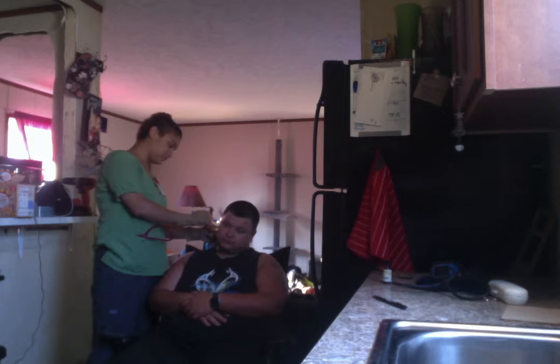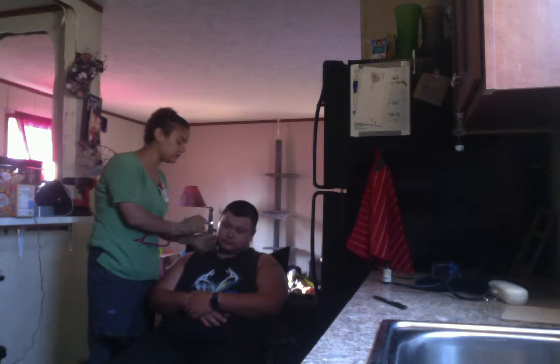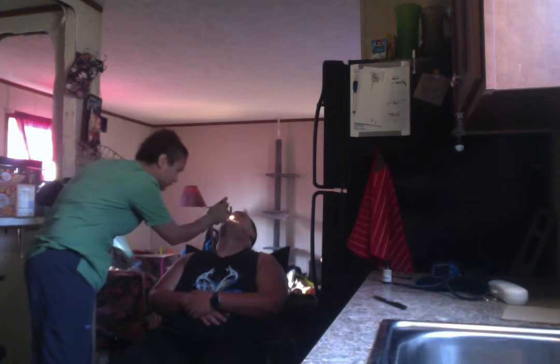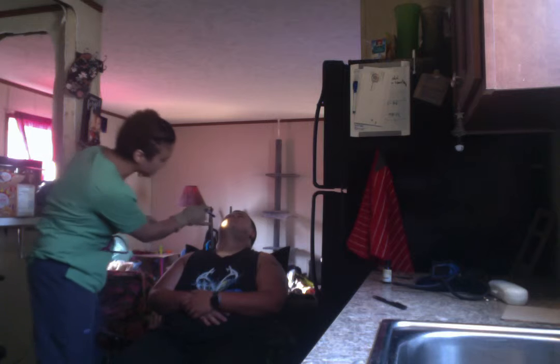Here's my otoscope. In the ear. I'm pressing along the mandibular for any pressure, any pain. I'm looking for any inflammation or redness. I'm also going to check the other ear and do the same with a little bit of pressure points. I'm going to check in the nose, looking at the septum, seeing if there's any blockage.